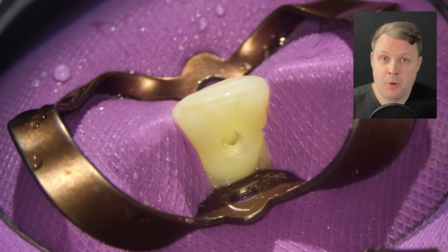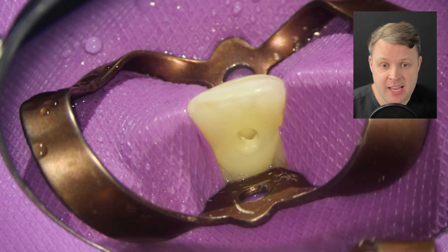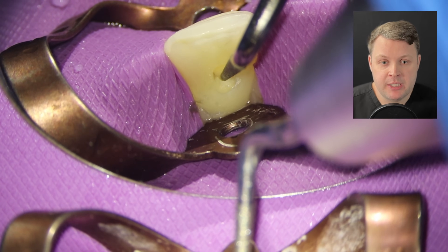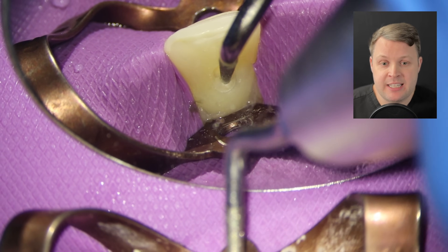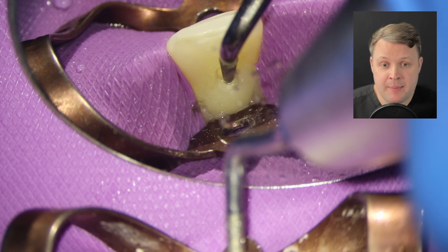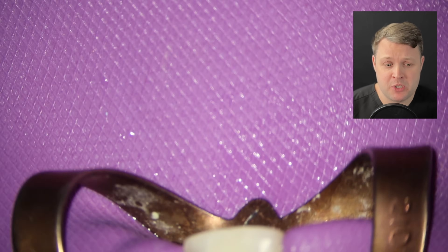Moving over to the clinical case from the young lady — there's an obvious breach here but the access cavity is not finished. You might ask why change tack now that we're in. First, you need to remove the palatal shelf — that bump palatally which impedes your straight line access. I tend to use a low-energy ultra diamond tip ultrasonic for this. If you're not into endodontics you won't have these and can use a fast handpiece, but you have to be super careful.